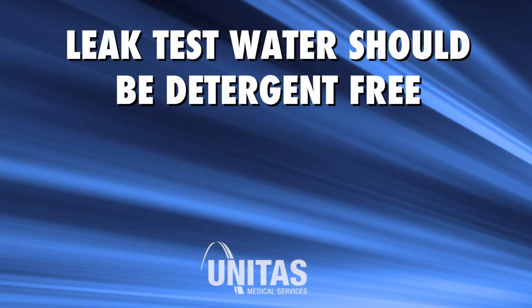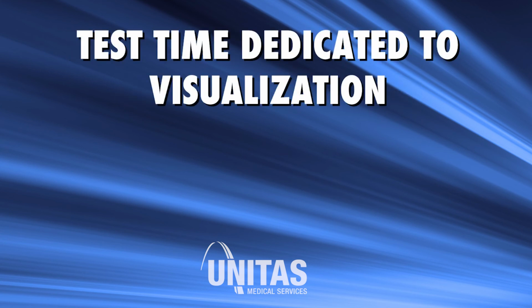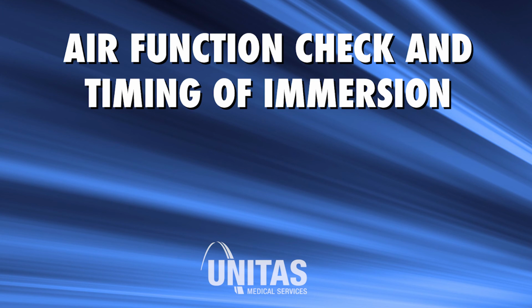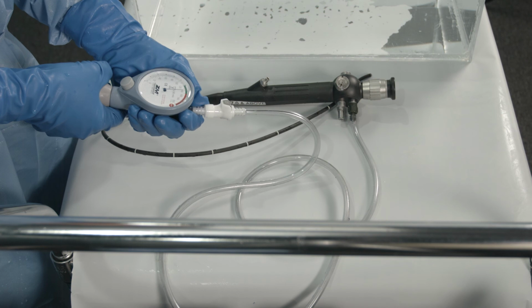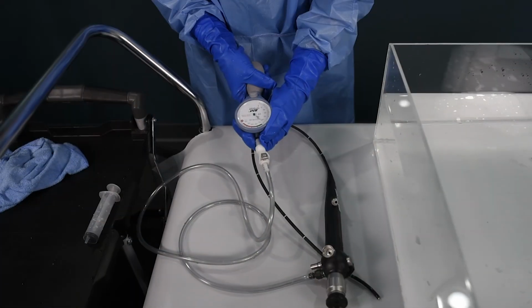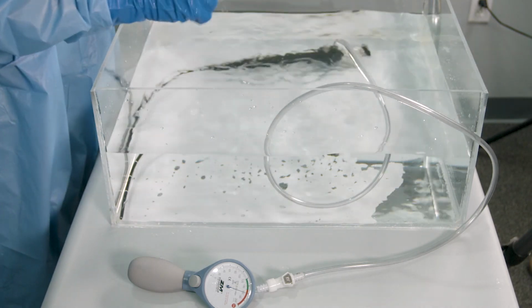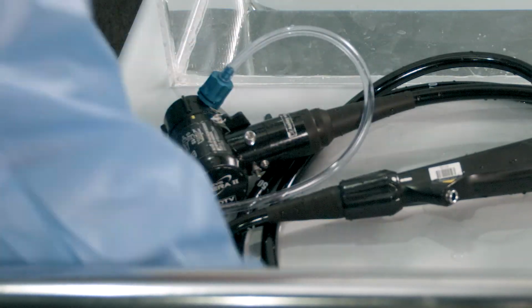Leak test water preparation. Leak test water should be detergent-free and the test time dedicated to visual examination, so there should be no scrubbing or cleaning initiated during leak test. Air function check and timing of immersion. Air function should be confirmed and insufflation initiated prior to any immersion of the endoscope in the water. Flooding the endoscope prior to leak testing is not recommended. The leak tester tubing adapter should always be connected outside of the filled sink.